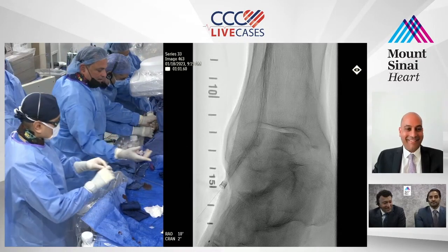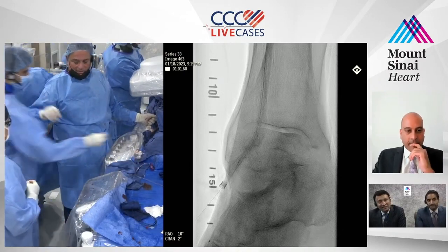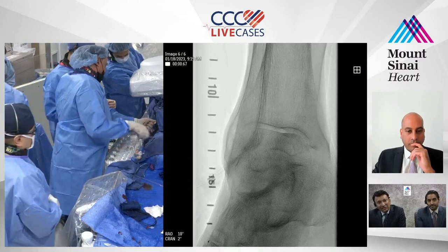Okay, pulling the catheter. Give me a clamp, mosquito. So what we're going to do now is we have Safari. Now we're going to just get us a... Oh, do we have Sterling balloon, guys, or no?